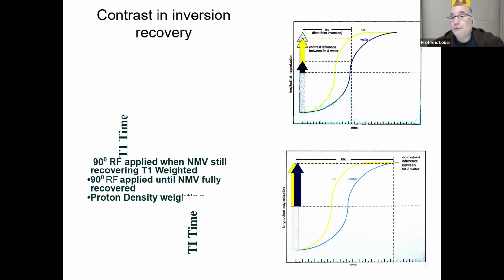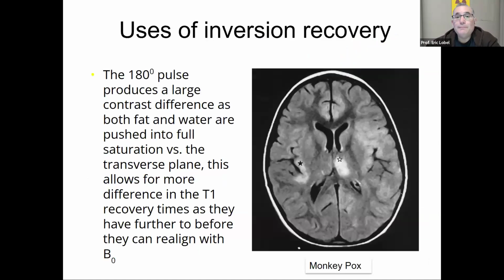So there's no reason you can't do that in MRI also, right? Analyze the pixel brightness levels, right? So that's the only reason I diverge into CAT scan a little bit, is because you could do that in MRI also, but you cannot do fat and fluid suppression in CT. It just doesn't work that way.